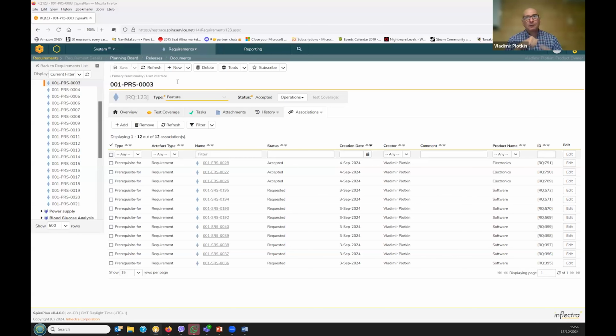And then when it comes to the actual V model, you need to provide the reports. You can generate test reports. So you can have your unit test reports, your integration test reports, and the system level test reports. It's fairly easy to do so. Vlad is completely right, in terms of test cases that are mapped to the requirements and stuff like that. That is definitely the starting point for the V-model for sure.